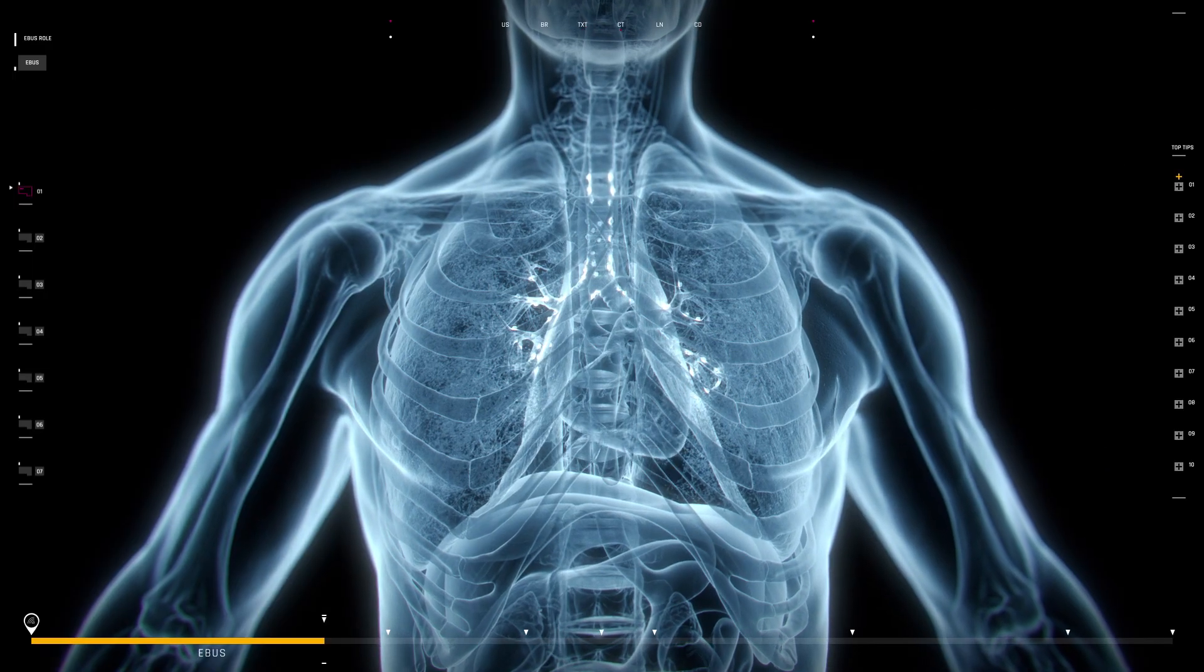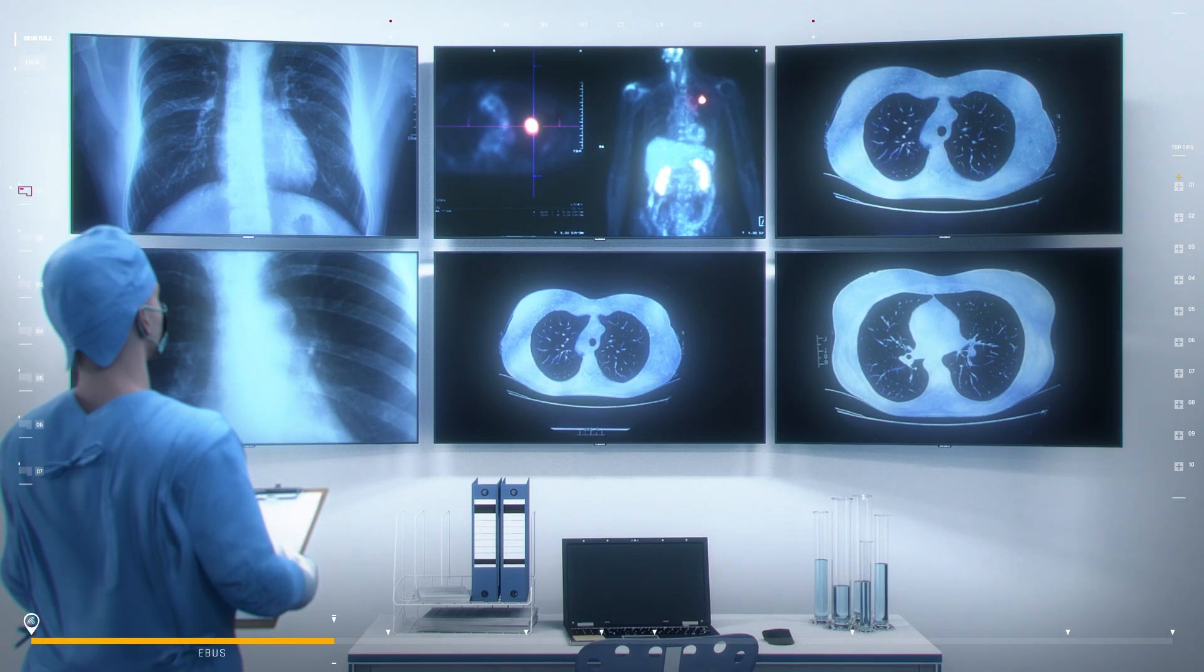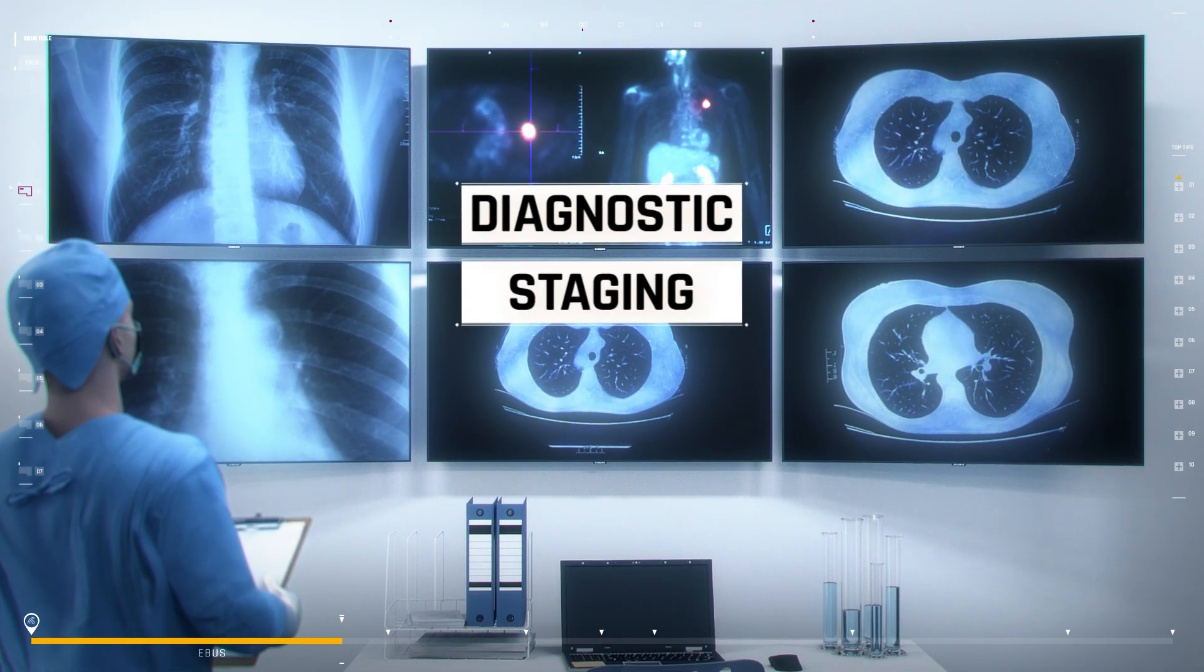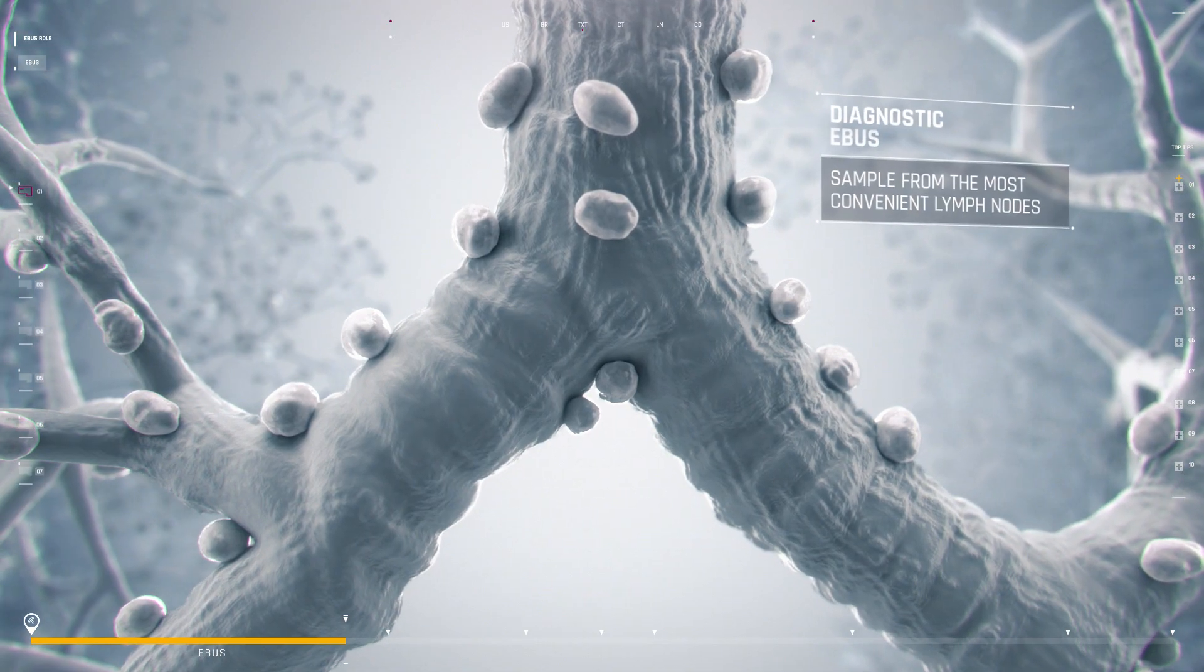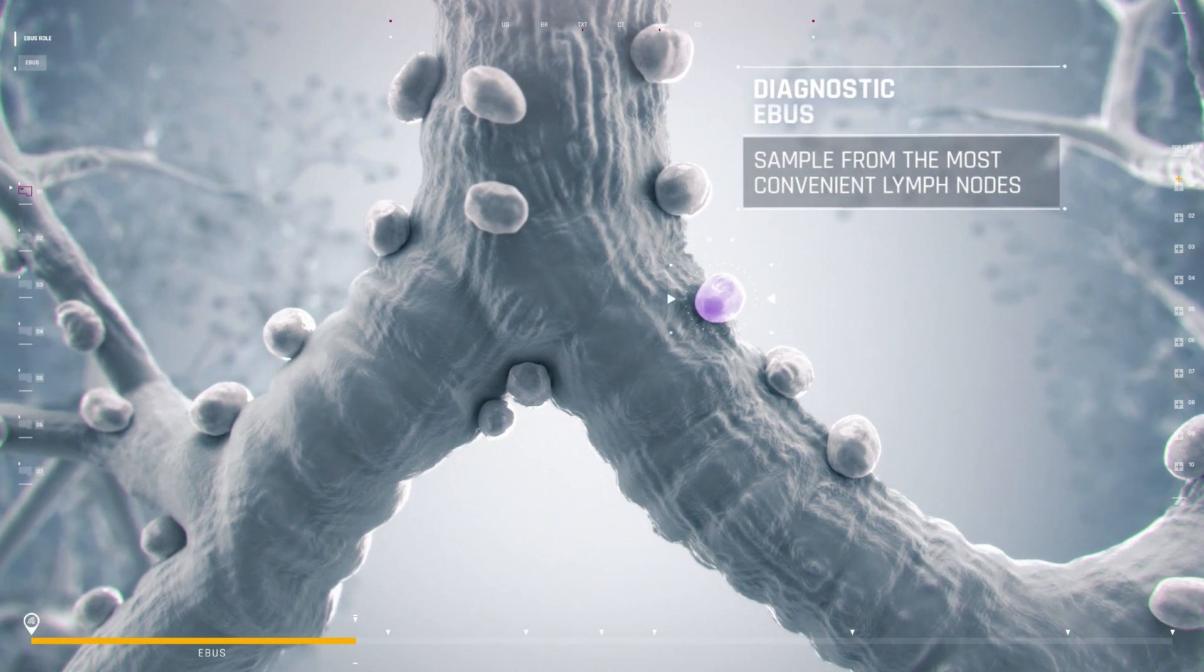When reviewing the CT or PET-CT scans, the operator must consider whether the purpose of EBUS is diagnostic, staging, or both. For a diagnostic EBUS, samples from the most convenient location are taken and maximized to allow testing of predictive biomarkers.